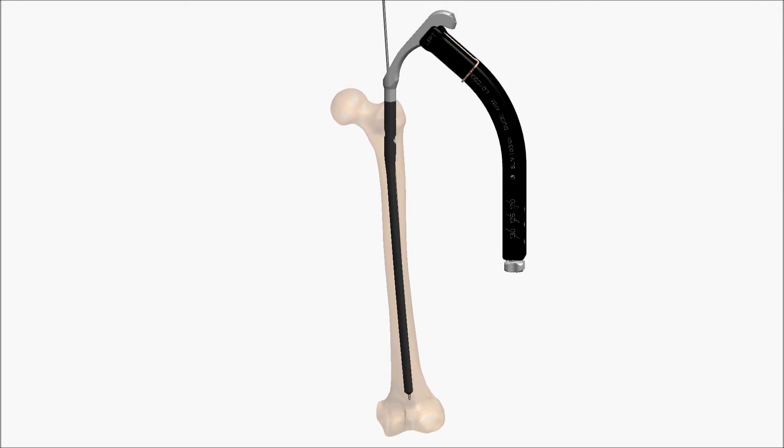Attach the impactor to the guide arm if additional force is necessary. Once the nail is in place, remove the inner wire.